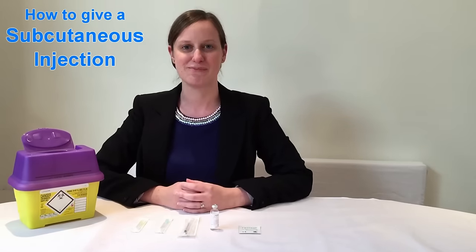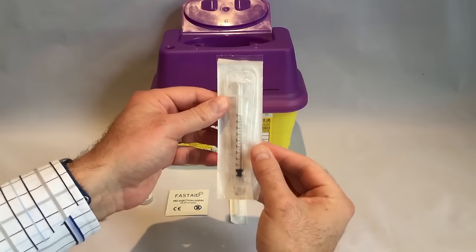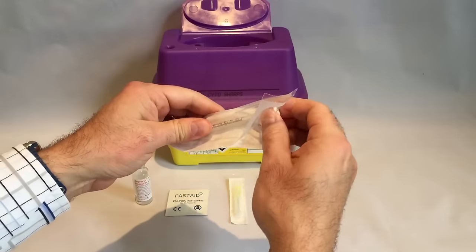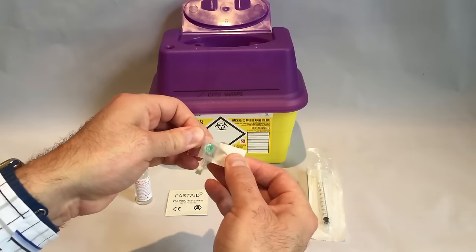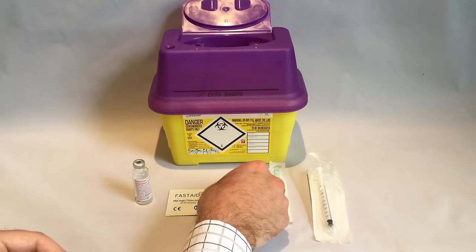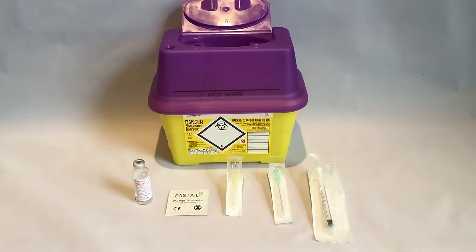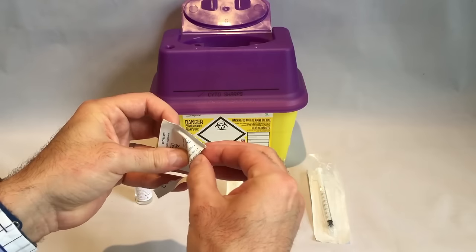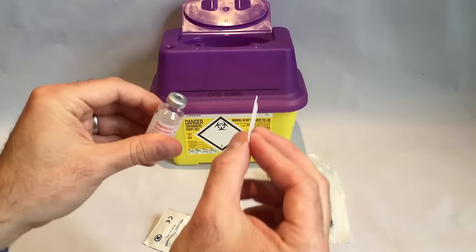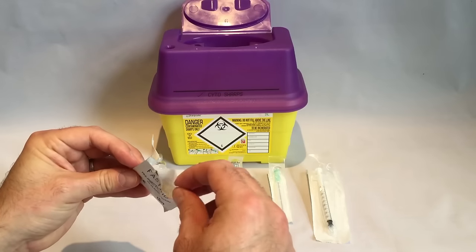Now that we've got everything ready we can move on to drawing up the injection. Before opening any of the packets, wash your hands thoroughly to make sure they are clean. Now open the syringe packet but keep the syringe within the packet as we will not be using it quite yet. Then pull back and fully depress the syringe plunger — this is to make sure it is not stiff and has free movement when we do come to use it. Open the packets for the needles but don't take them out just now. Tear open the alcohol swab carefully along one edge so you don't tear the swab inside, and take it out of the packet. Use the swab to clean the top of the medicine bottle, then put the swab to one side and let the top of the bottle air dry.